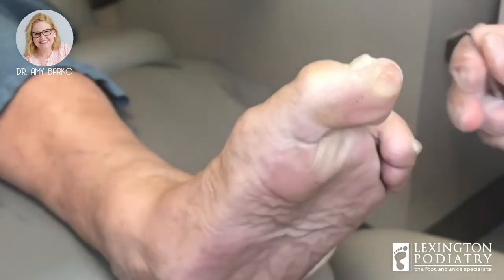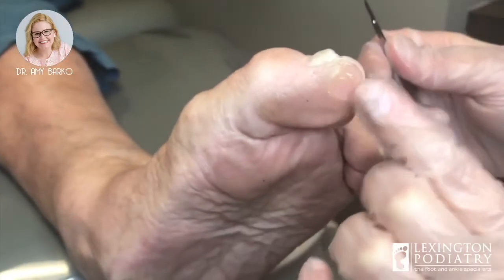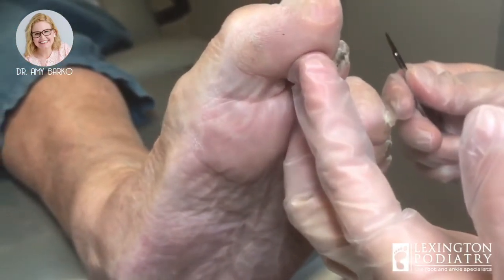He was so good. So again, here, the ridge, I'm not too concerned because I know that one of my assistants will come in and help me buff that down with a Dremel. And there's a little bit up here. So this is how we trim a callus here at Lexington Podiatry.